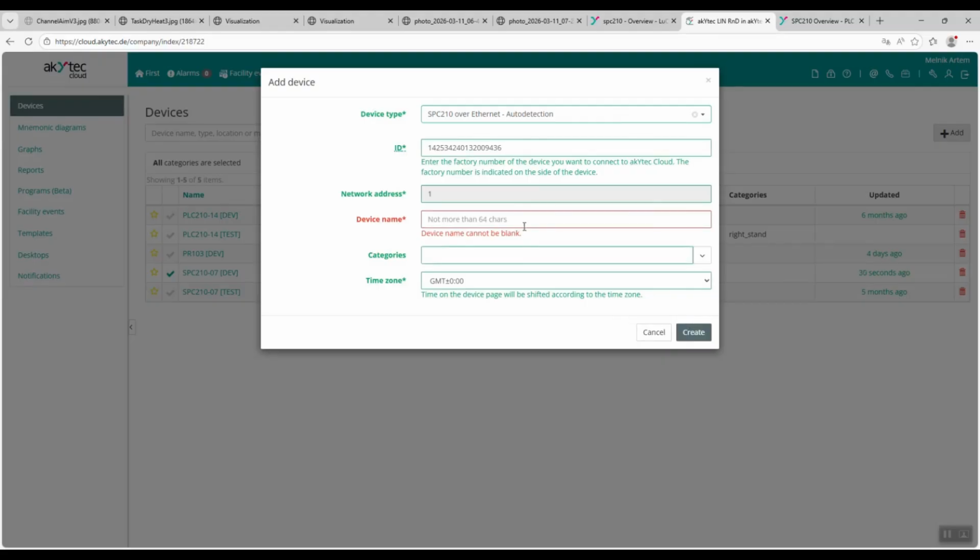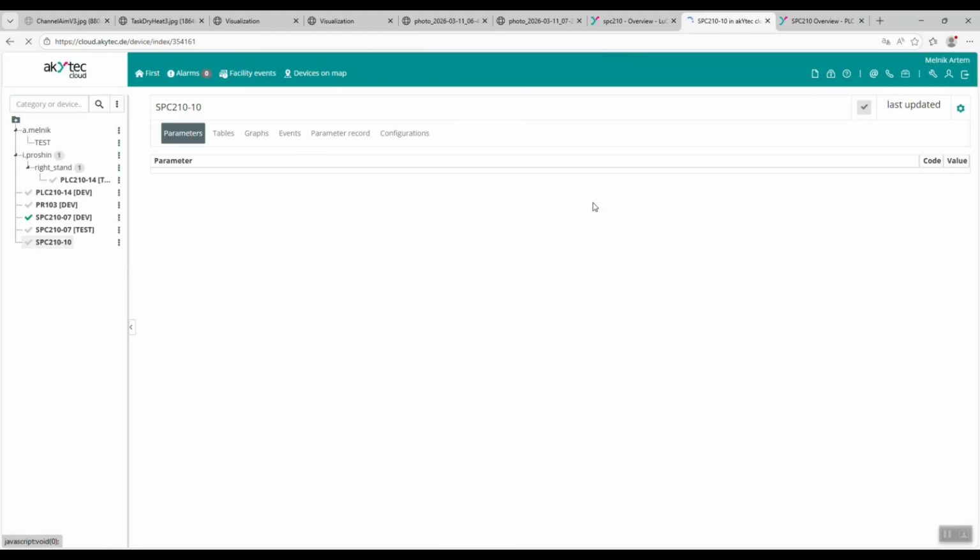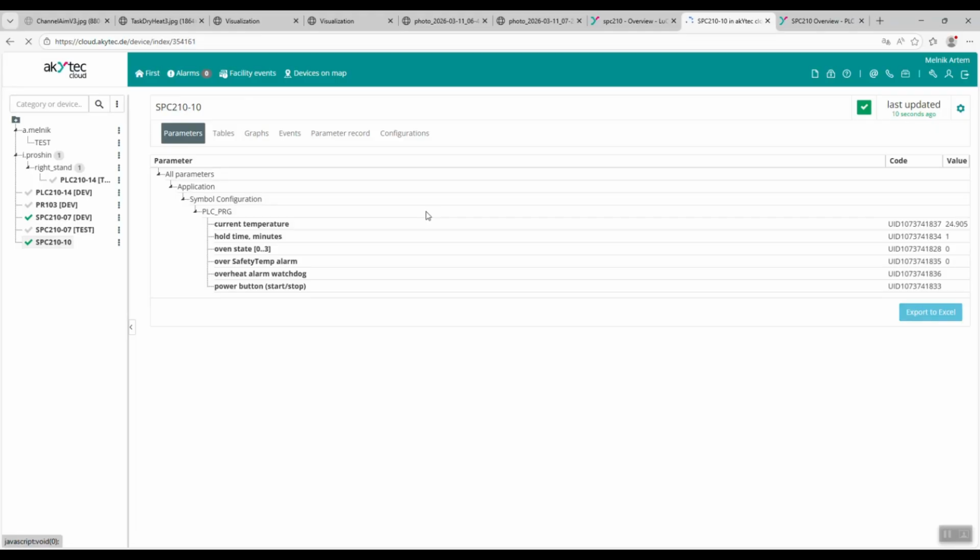Click Add. We also need to enter a name for the device. Now we need to set the same password that we just saw in the akYtec cloud component. After a short while following the addition, the cloud service will automatically upload all variables from the controller that are marked in the symbol configuration. Notice that instead of the variable name, the comments are displayed, which is also very convenient.